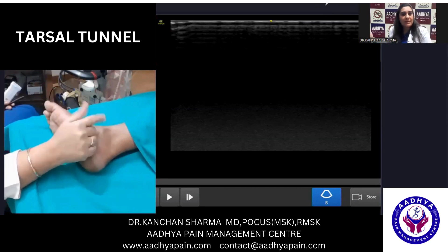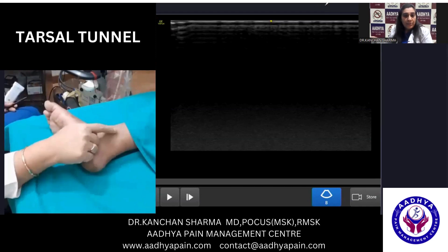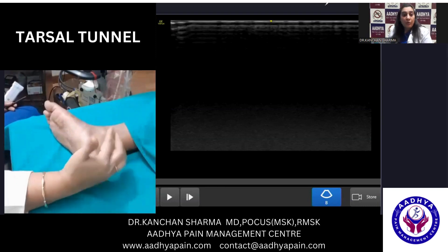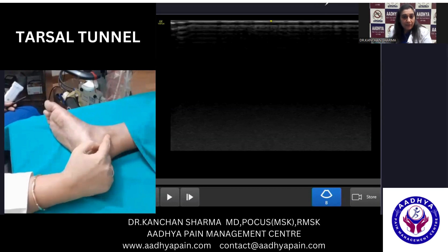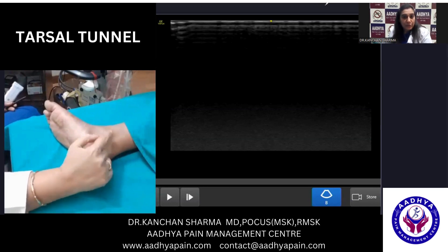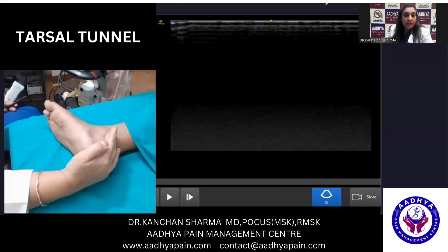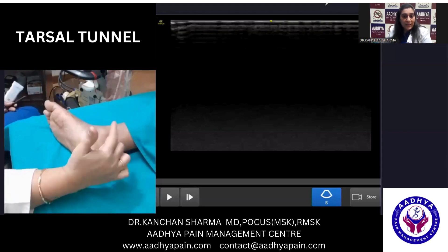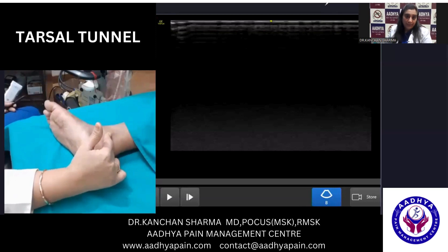This medial malleolus also has got an anterior colliculus, posterior colliculus, and intercollicular area. What you are supposed to do — if this is your medial malleolus — you are supposed to orient your probe in such a manner that the aspect marker you just keep, palpating this bony thing with one finger, and keep the probe in the short axis with the aspect marker lying exactly on this bony point.